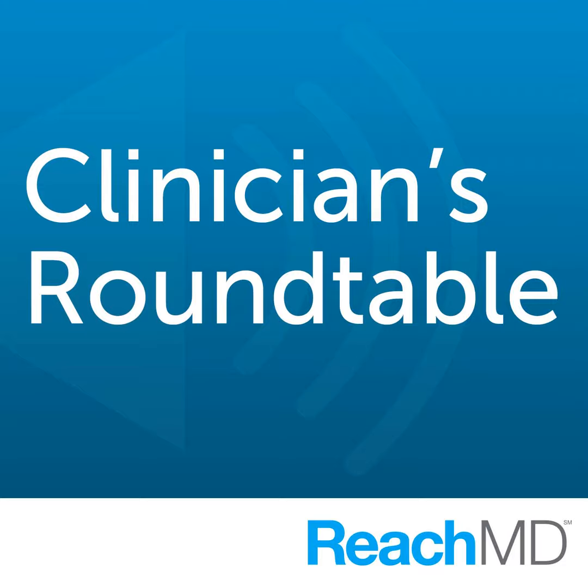In simplistic terms, how are you actually physically doing this with virtual reality? Well, you take the digital anatomy on a CD, you send it to currently a simulator company that then can put it on a simulator. You then can practice the technique on that simulated anatomy, get it right, and then work on your desired patient's anatomy in the real patient.